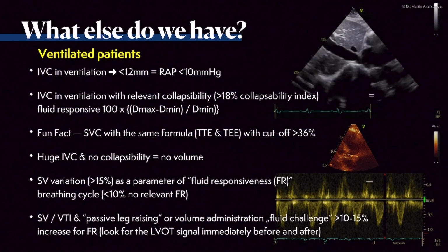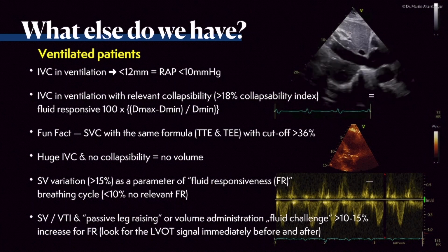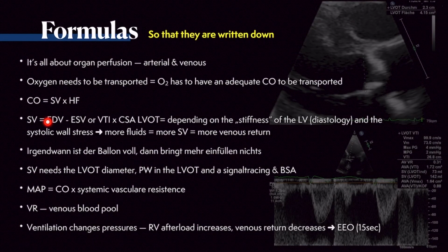Of course, you have to have an optimal LVOT signal with pulse wave Doppler. You have to measure the signal before and immediately, and I would also recommend during a fluid challenge, during the passive leg raise test. What it is about, so that we are also discussing some more formulas, is something you can, for example, print out or take a photograph of, so that you simply have it written down.